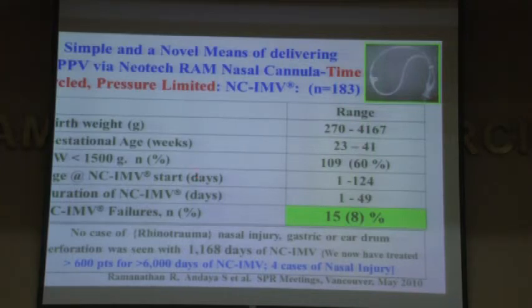As I mentioned before, we have used it from 270 grams to 4 kilos. Failure rate, 8%, required intubation.